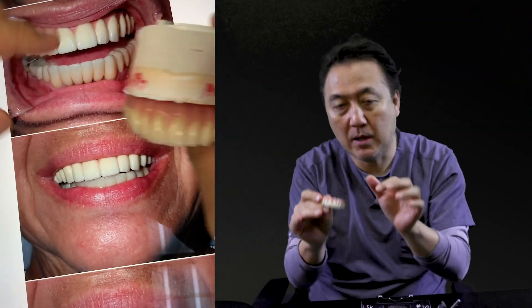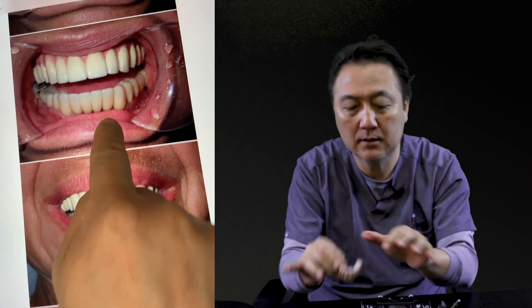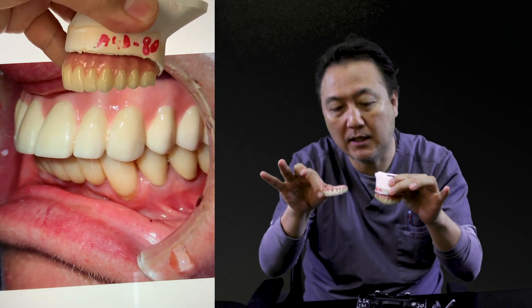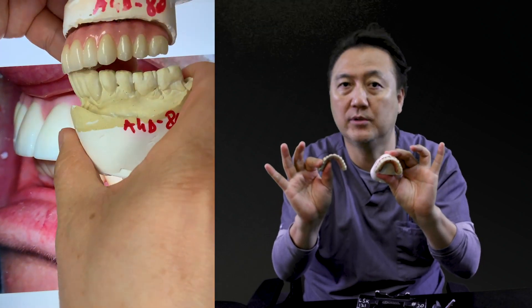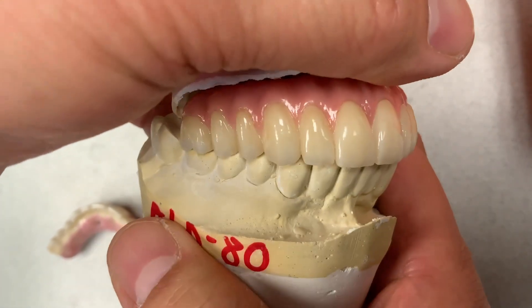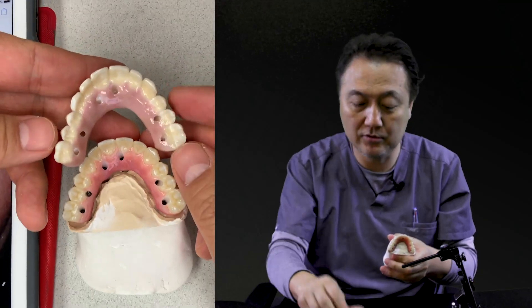Nowadays, technology is faster and zirconia materials are getting better, so we're getting more translucency than before. Remember, this is a monolithic, and this is a monolithic as well, so translucency is different. Our technique is also different — much better. So we finish this with color, side view, and especially occlusion too.